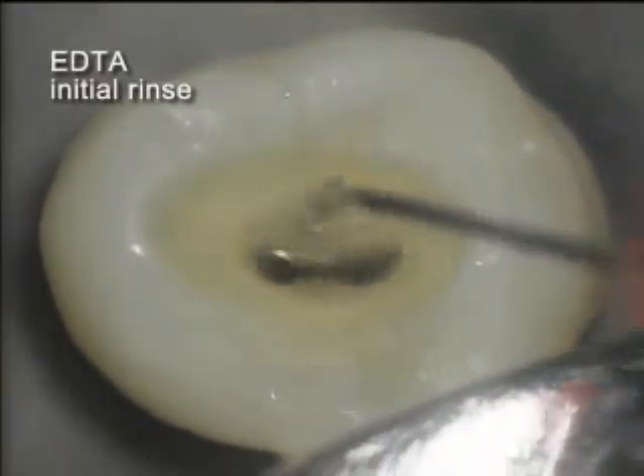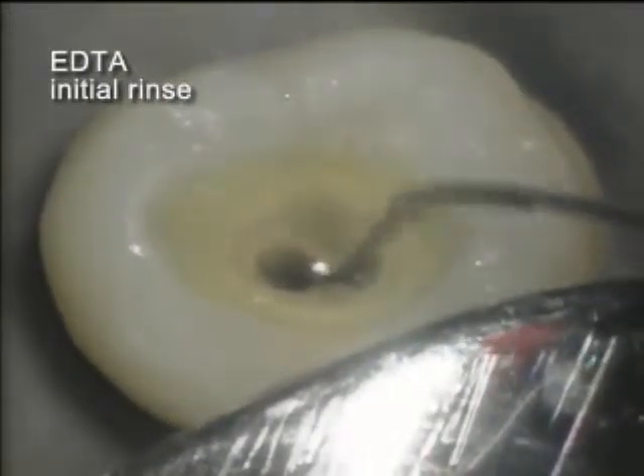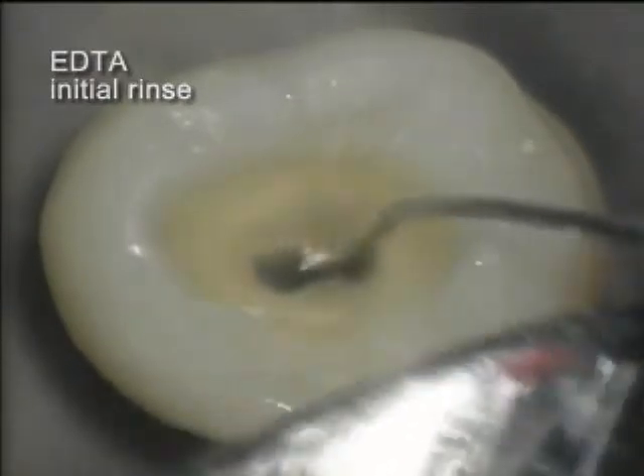Suction evacuation is being used, but no debris materials are seen. The currently accepted protocol for endodontic usage of EDTA is a one-to-two-minute soak before another rinse and evacuation.